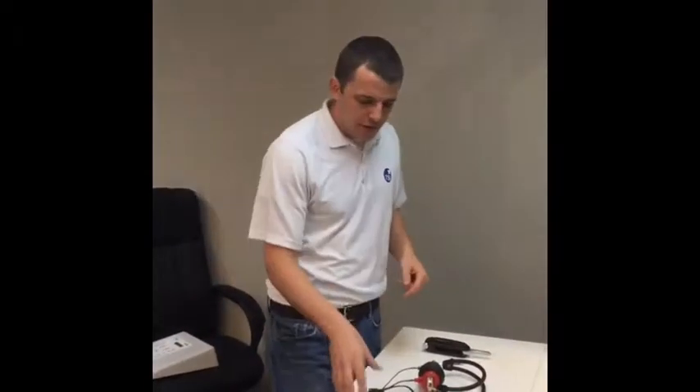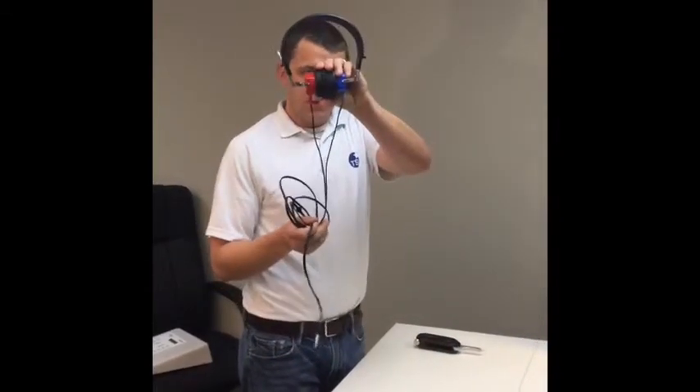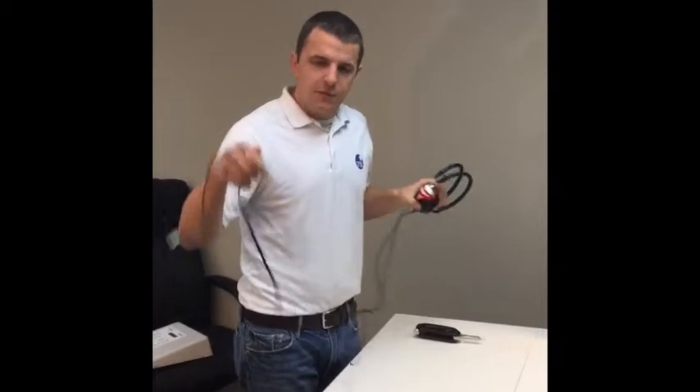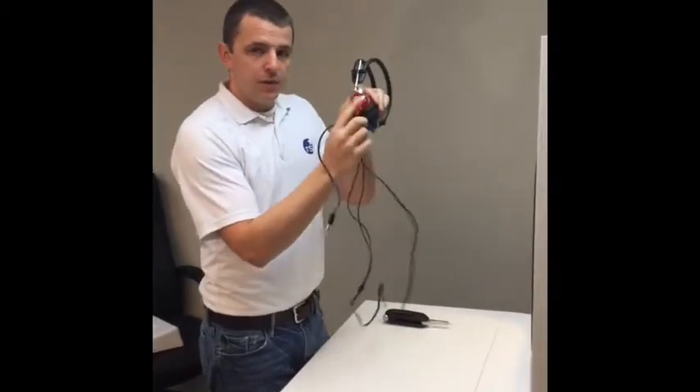This is Steve Smith with TSI and today we're going to go over how to replace an audiometer headphone cable. Most headphones will look just like this. Some will have two jacks at the end but this one has one. It doesn't matter because we're going to be doing all our work up here at the headphone.